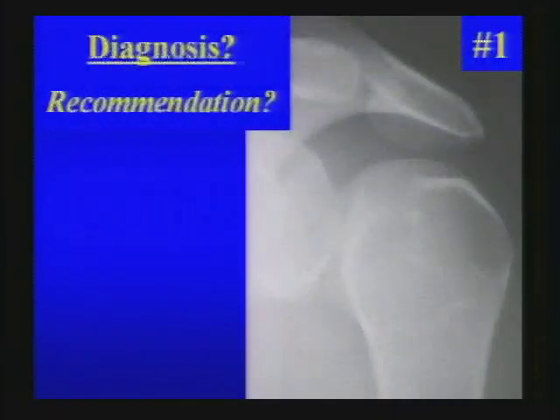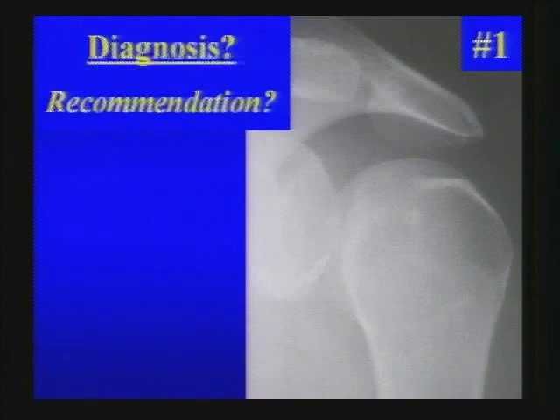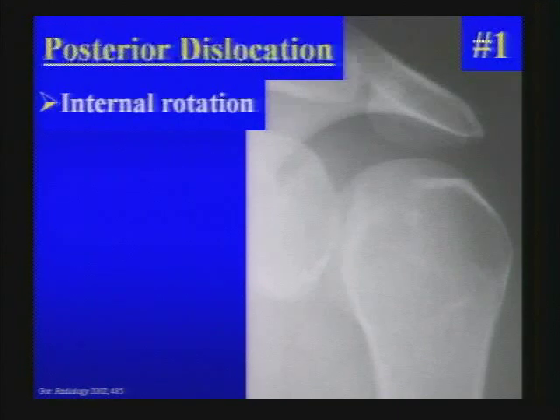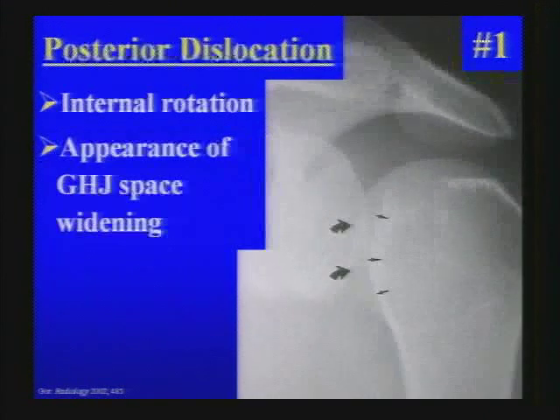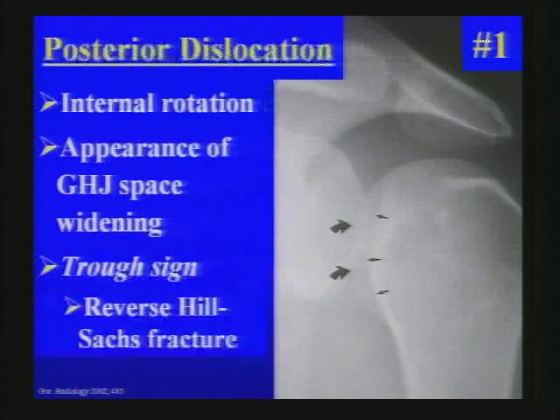We're going to go pretty quickly talking about some interesting cases that are practical not only in everyday life but also in the month of May/June. Here we're dealing with a posterior shoulder dislocation. You can see on this frontal radiograph the humeral head is in internal rotation, giving the appearance of glenohumeral joint space widening. Note the subtle trough sign, which is a reverse Hill-Sachs impaction fracture.